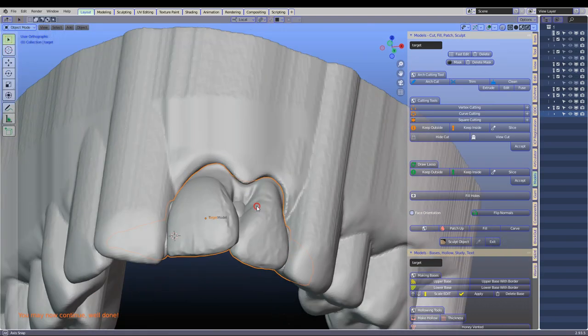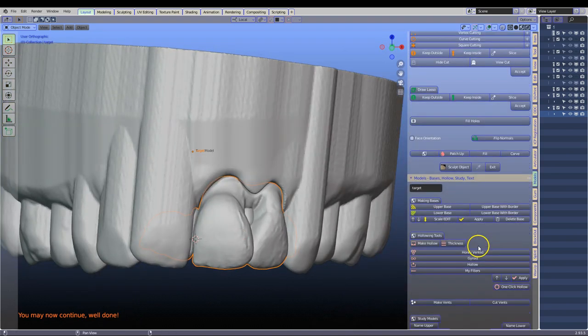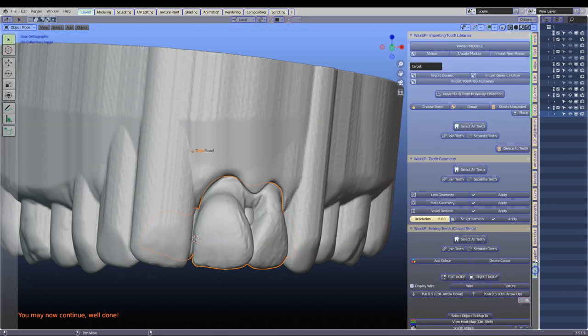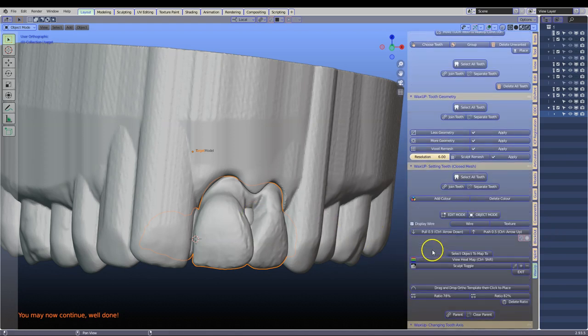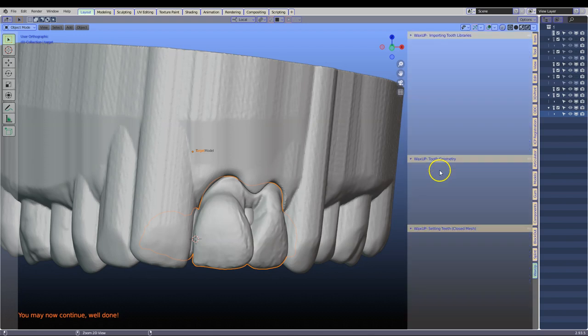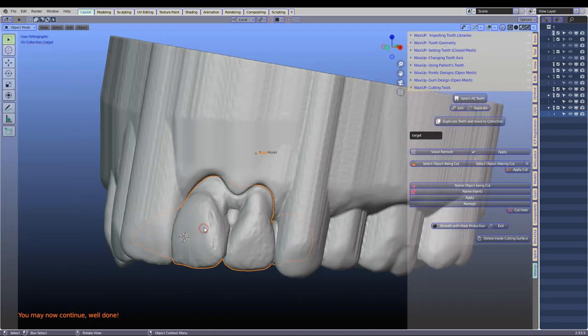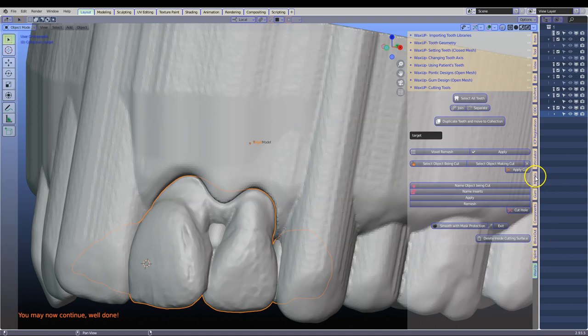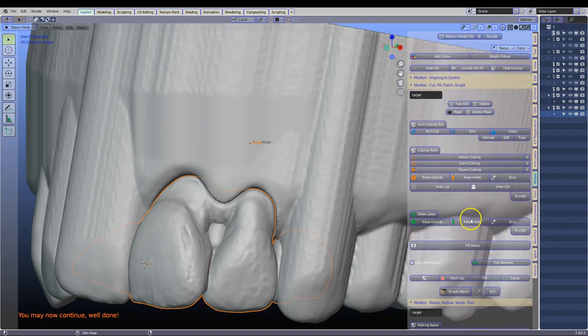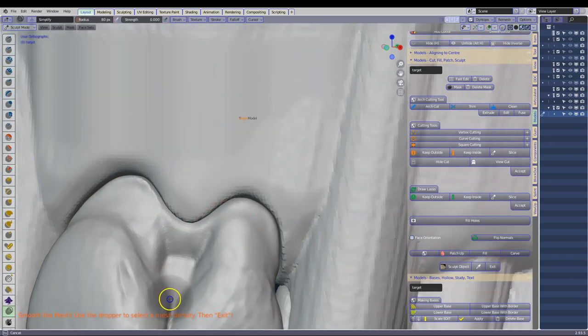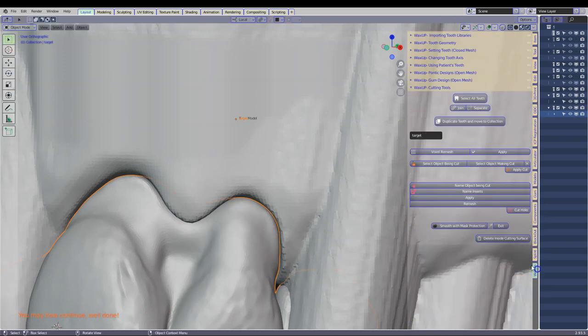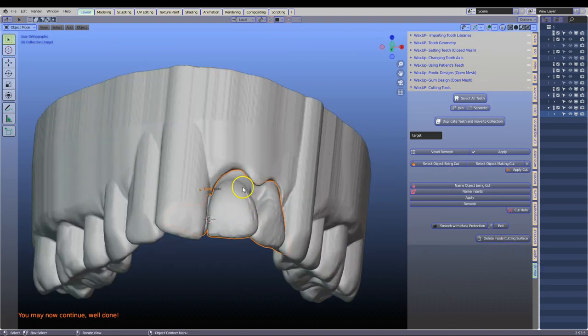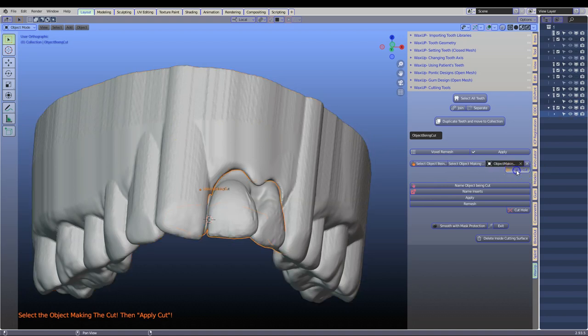Finally what we want to do is cut the fitting surface. Go to the wax up or the one of these, the splint module, the wax up. Then what we are going to do is go to the cutting, fitting surfaces, the cutting tools. Oh I forgot to smooth that a little bit. So I will just go back to the model designer. And smooth. Sculpt smooth here. Like that. Exit. So this becomes our model, our object being cut. And that's the object making the cut. And then apply that.